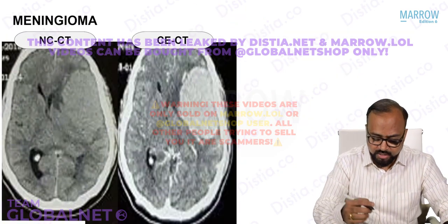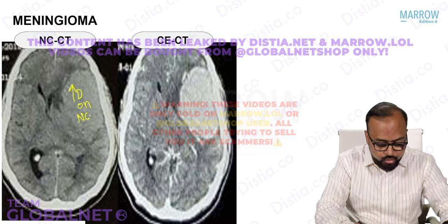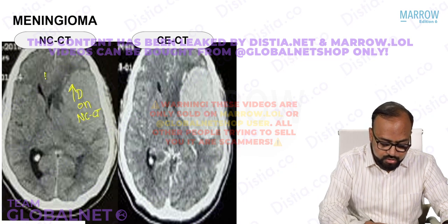Another feature of meningioma is that it appears hyperdense or white on non-contrast CT as well. See, this is the normal brain.